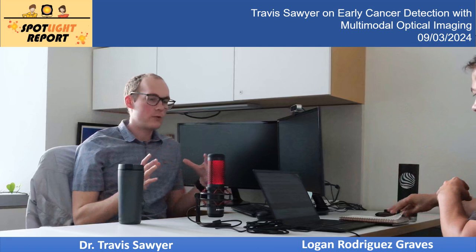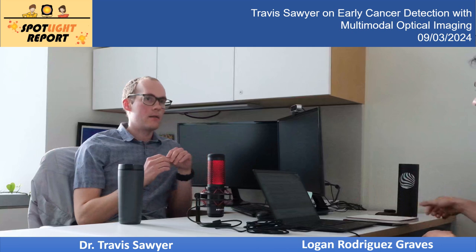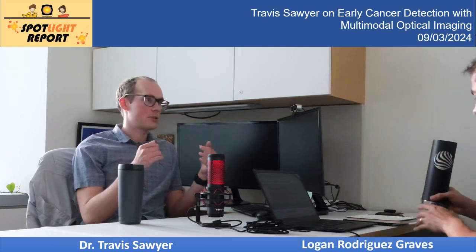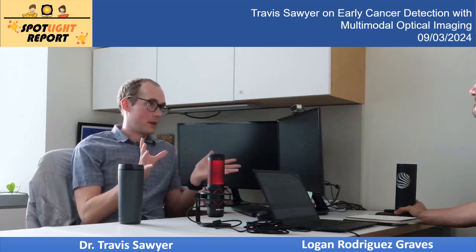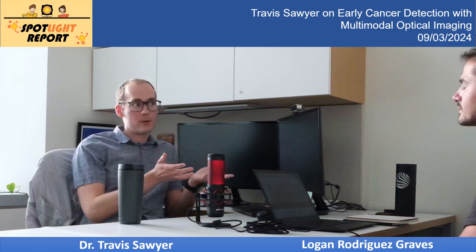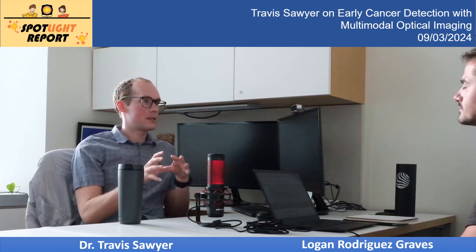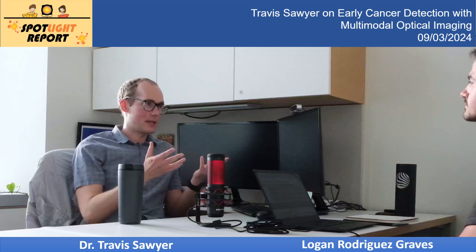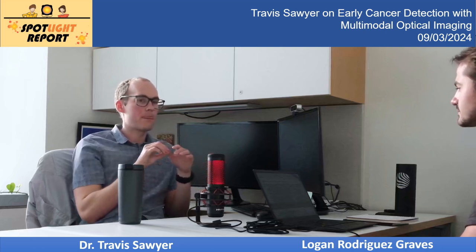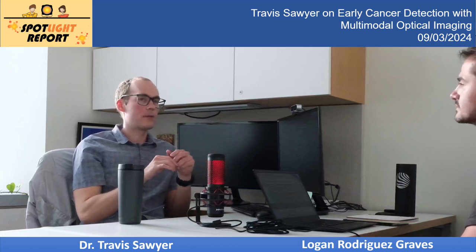Absolutely. So I think what you described is pretty common among image analysis pipelines in general. And the concept of segmentation, that's essentially removing unwanted parts of your image. That is relevant for things that are like OCT, where you might do a larger area. For example, we were imaging a bunch of ovaries. In this case, it was mice, so they were pretty small. And we wanted to have some kind of analytical pipeline that automatically gave us relevant numbers, and we didn't want it contaminated by the background. And so segmentation was removing that background information from the actual tissue. Something like multi-photon, we didn't need to segment because it had a small enough field of view that everything was relevant.